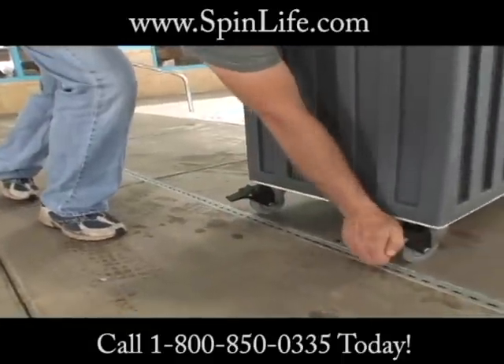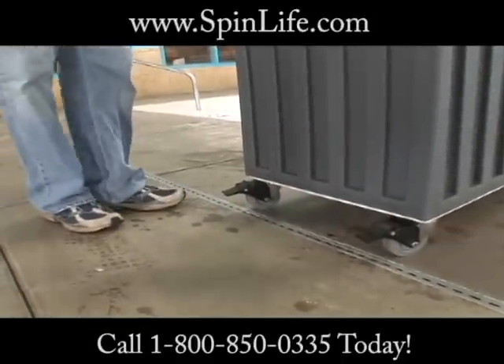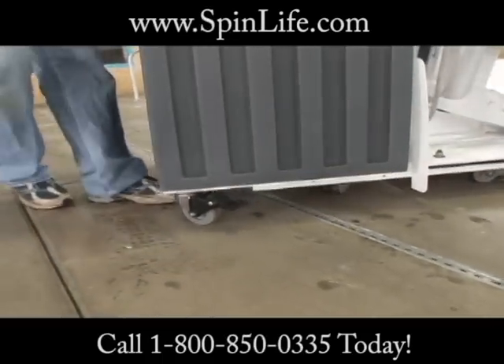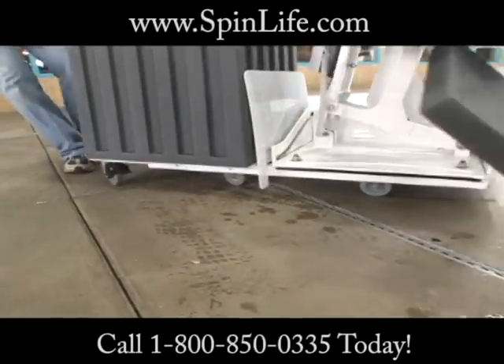The Patriot Lift incorporates durable three and a half inch stainless steel frame casters, with rubber wheels and locking brakes, giving the lift complete portability over most solid surfaces.